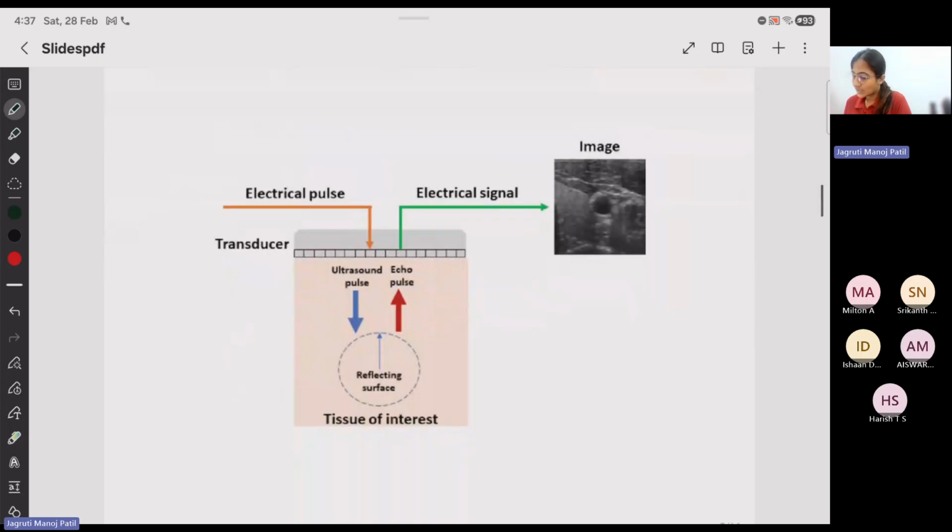So this is how it works: you have a transducer, and within it you have this piezoelectric crystal in between. These crystals are materials such as quartz, PVDF, which is polyvinylidene fluoride, and lead zirconate titanate. So you have different types of crystals, and nowadays people are also using polymer based films. They are doing CMUTs, and then you have PMUTs. There are different parts to it. It's a whole fabrication, microprocessing based field, which is a different part, in materials and electrical electronics.